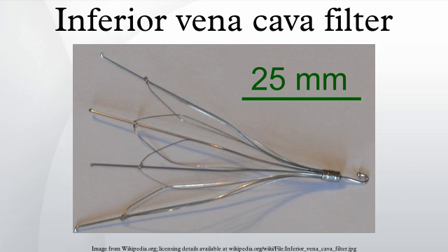Most patients with weakly or non-safe ferromagnetic implants will be given a card, which they keep on their person at all times, that can help isolate if it is safe to do an MRI. For patients who have been denied MRI scans for safety reasons, doctors usually recommend the CT scan with contrast as an alternative. Labeling and recommendations.